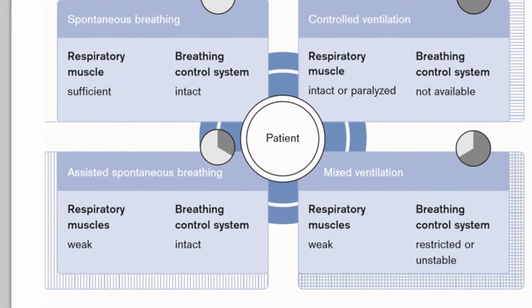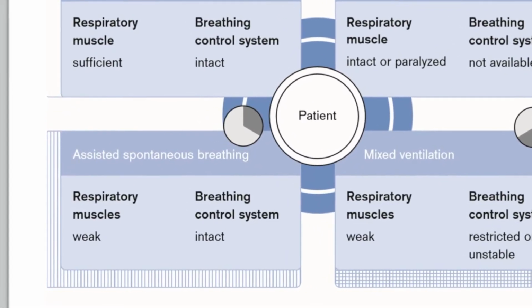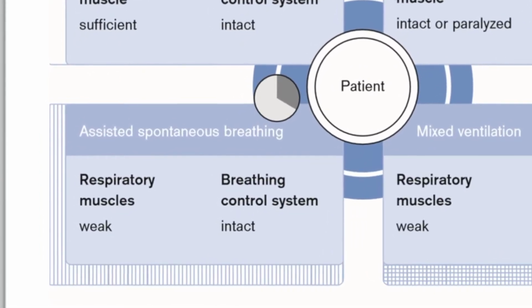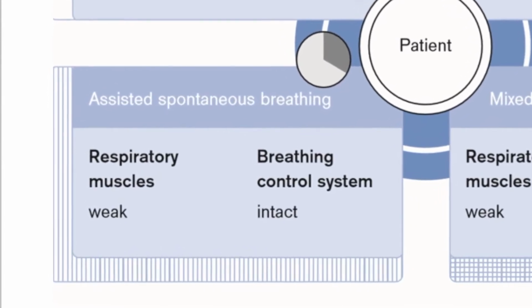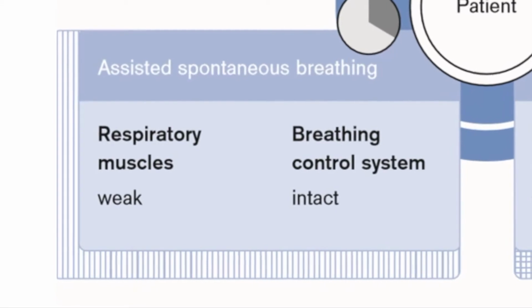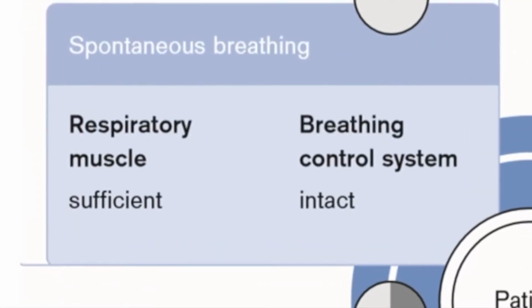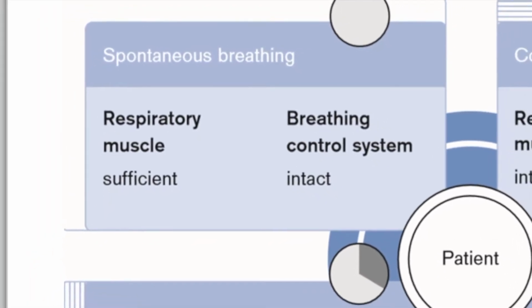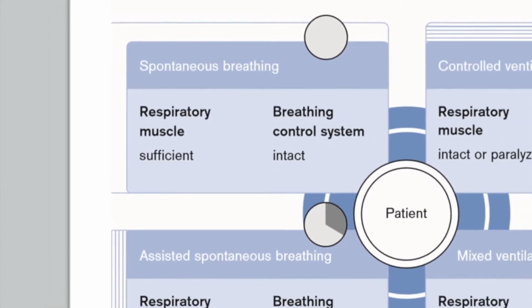Now, because he's not all there all the time, the spontaneous modes also offer help, certainly with pressure support to make sure that the right sort of tidal volumes are available, but also assisting if the patient sometimes forgets to breathe. And then once he's completed this part of his journey, it's probably time for the patient to be extubated to go to pure spontaneous breathing on his own.